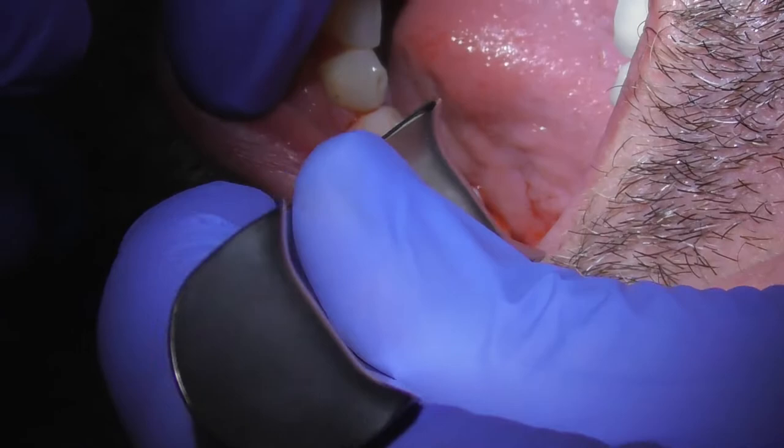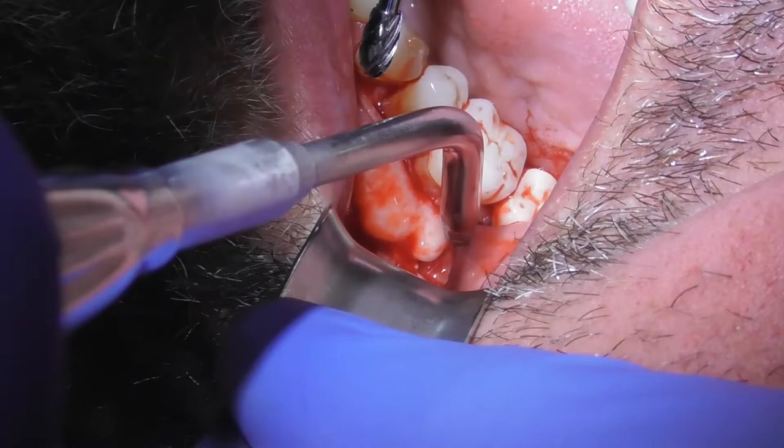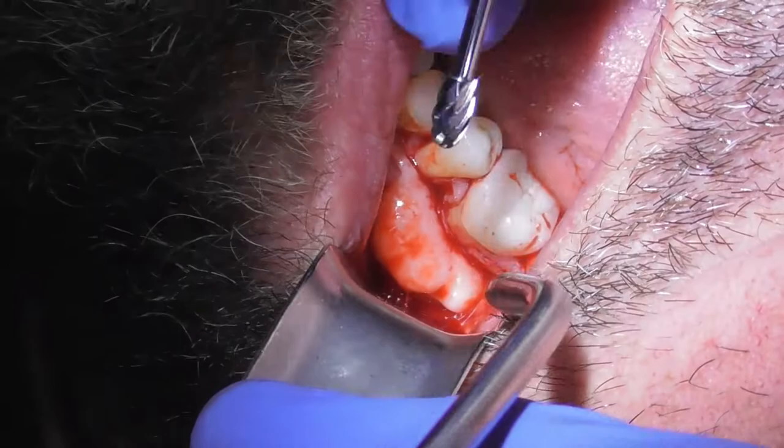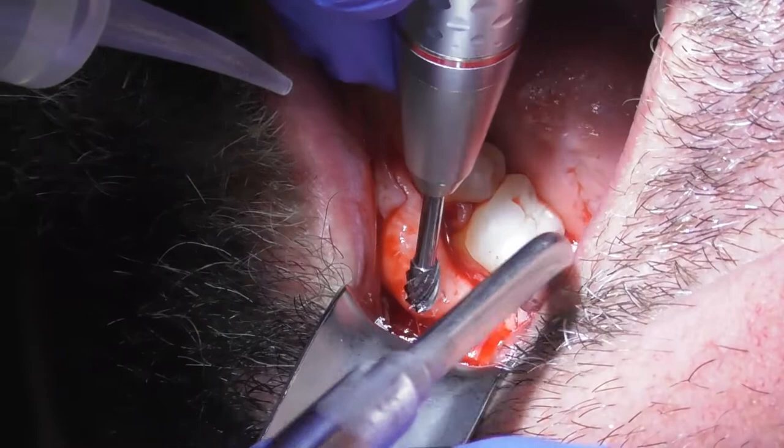You're done with the hard stuff — you've got the local on board and I've already got the tissue back. This is a little weird with just the vibrations as we smooth this down. My instrument here is called the Minnesota retractor — it just kind of holds everything back. We're going to irrigate with some sterile saline, some cool water, just to keep things lubricated and cool. Some vibrations here as we just start to smooth this down.